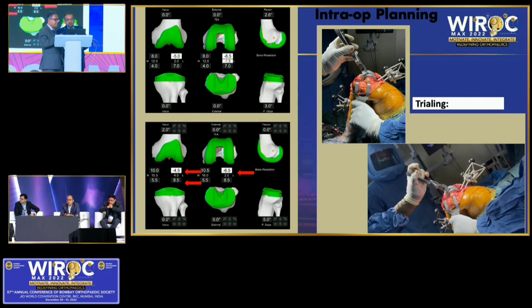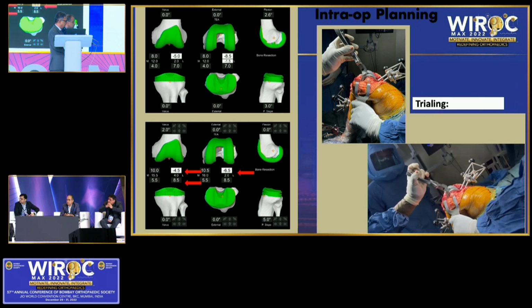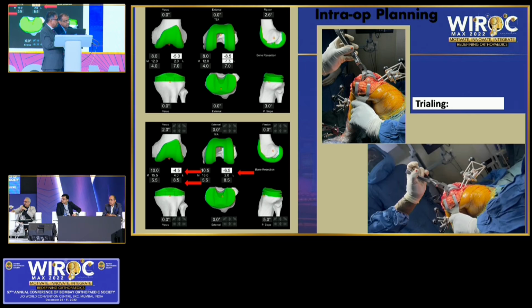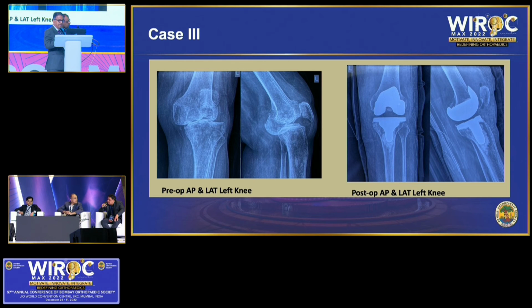And there are papers suggestive that the residents and fellows who have done TKRs by robotic, their alignments are better than the alignment by the professors who have done conventionally. In that sense, it is disruptive. I think that's probably right. But one should have a knowledge of conventional TKR without fail. I don't think that you can do without conventional knowledge. What I'm trying to say is that somebody with 2 years experience and some 100, 200 knees will struggle to get the rotation right in that particular patient. But the robotic surgeon will get it right. To put it safe, a good conventional surgeon is going to be a good robotic surgeon for sure. If you are not a good conventional surgeon, you are not going to be a good robotic surgeon, according to me.